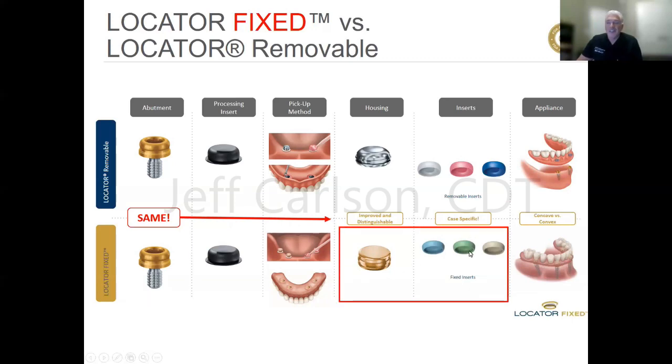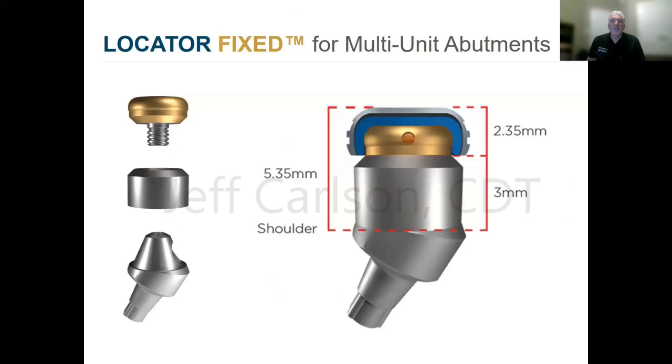They're case specific, as it's referred to, but once you've picked these up, you can take the denture, cut the borders off that denture, and backfill the concavity in the denture with acrylic, and literally do some type of retrofitting. It might be a little bit much for you to do chairside, but just be aware of it. I would encourage you to look into it more and make a decision for yourself if it's the way you would like to go with the case.